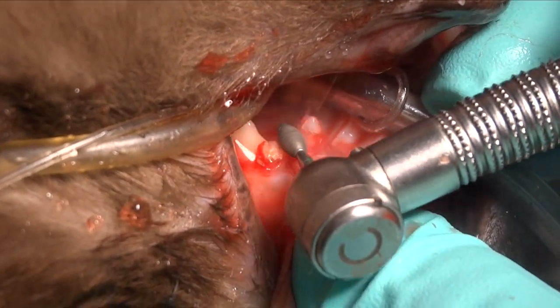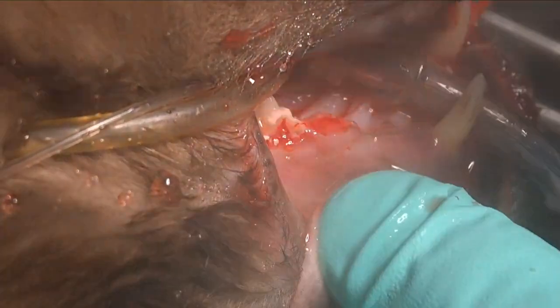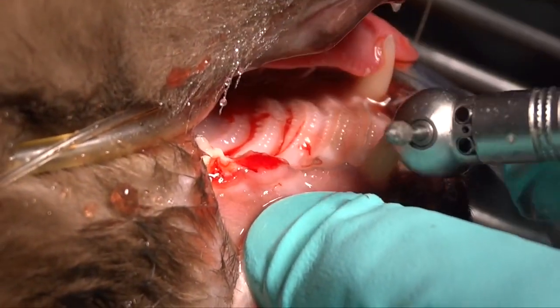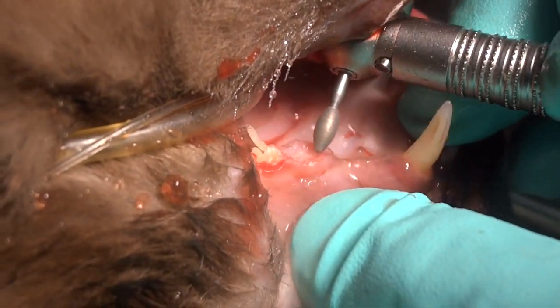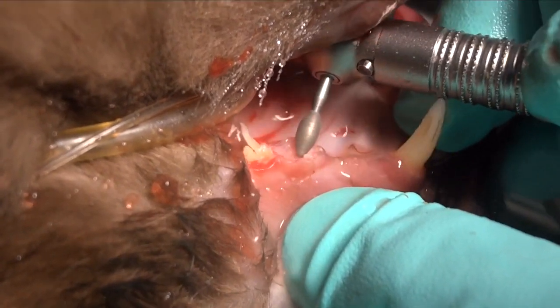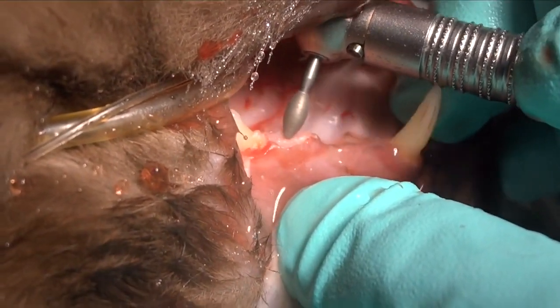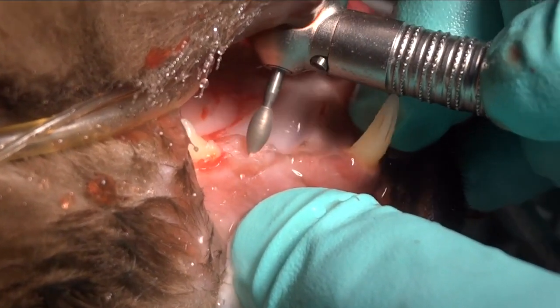Here we're using the wide end of a diamond football burr to eliminate the crown. You can see how quickly that happens, and then we can come back with the tip of that and work around the edges actually beneath the gingiva without hurting it. That's a very safe diamond football burr that allows us to do that.